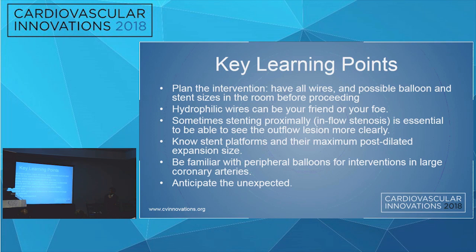I think it's important to have all your wires and balloons and stent sizes in the room before proceeding. You never know what you're going to get into. A bit of a surprise. This was, I thought, maybe just a focal stenosis to the right, and it ended up showing the right angiogram to look like a complete mess, and not exactly what I expected when I started the case.